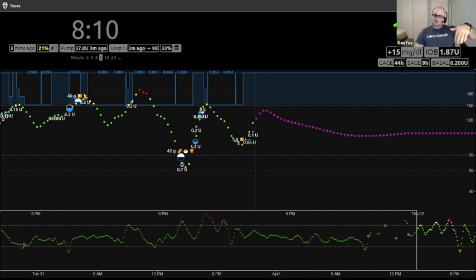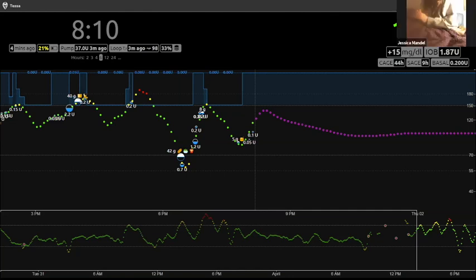What is Nightscout? It's an open source website that was designed a long time ago to kind of do what Dexcom Share did before Dexcom Share existed. That was kind of its main thing. It was created by a couple of parents trying to collect their own information, and then some of their parents jumped in to try to collect their kids' information, and they kind of wanted to manage everything in one place. That's oversimplifying the history of Nightscout, but nonetheless, there it is.